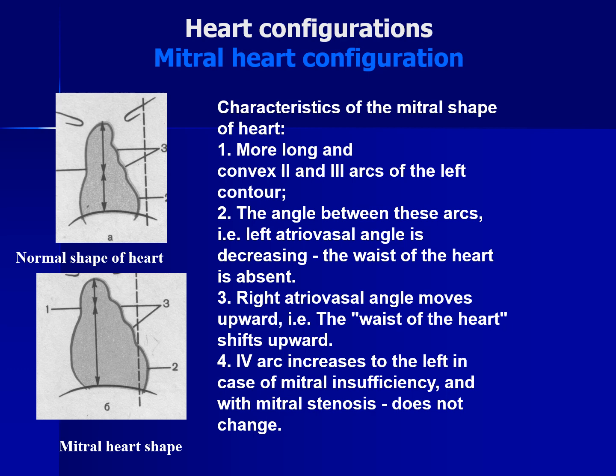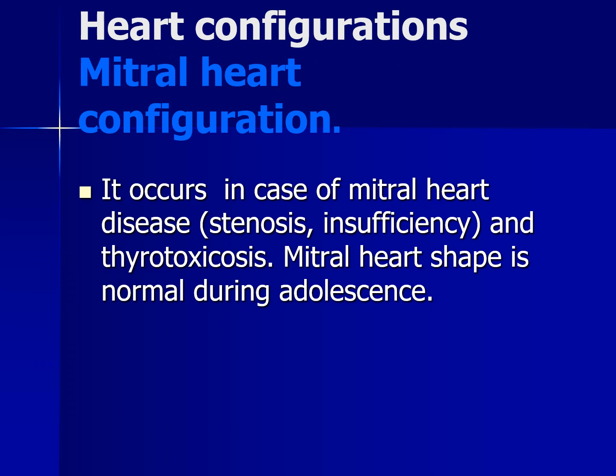And the fourth arch increases to the left in case of mitral insufficiency, and with mitral stenosis it may not change. Mitral heart configuration occurs in case of mitral heart disease, stenosis, insufficiency, and thyrotoxicosis. Mitral heart shape is normal during adolescence.